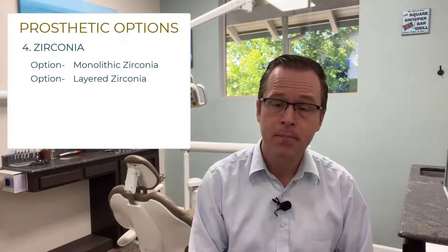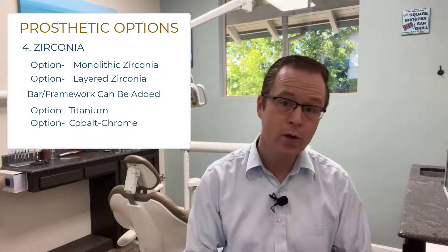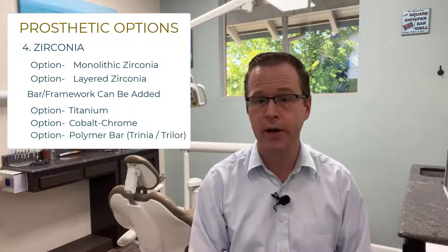Additionally, you can certainly do monolithic or layered zirconia — both monolithic without a titanium cobalt chrome bar, or you can take zirconia and combine it with a titanium cobalt chrome bar or a polymer bar such as Trinia or Trilor.